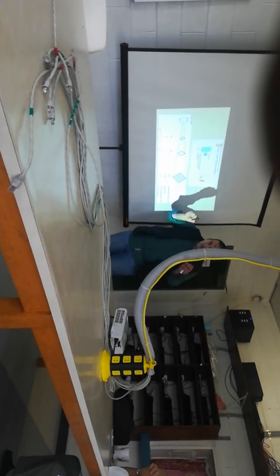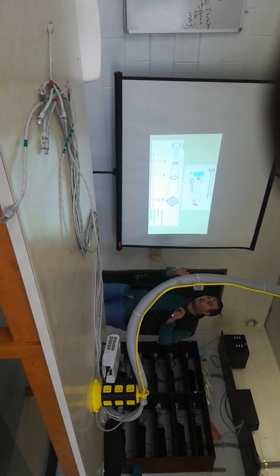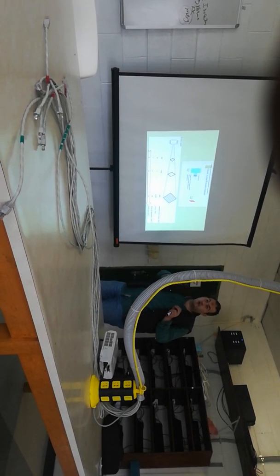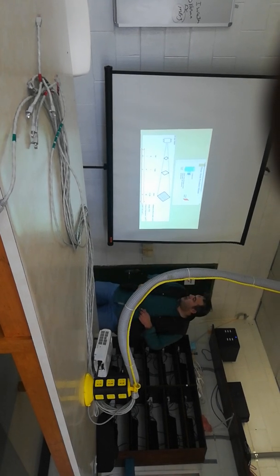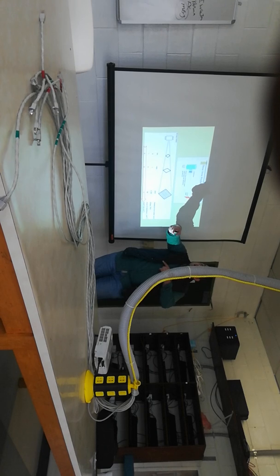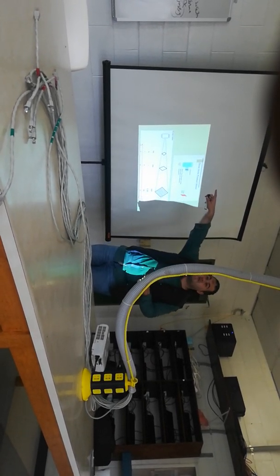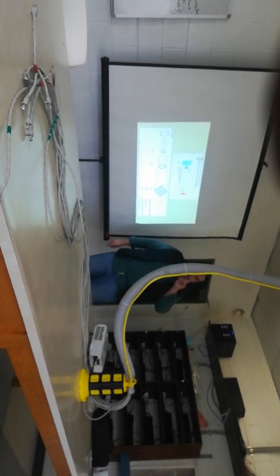So now you understand what I mean by the same number of photons. This value of the dose area product will convert to effective dose when I multiply it with the conversion factor, which is 0.01 for extremities.